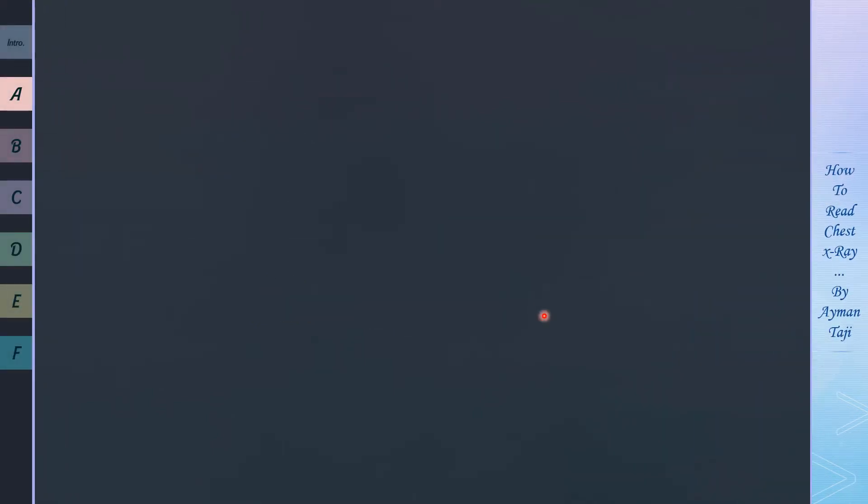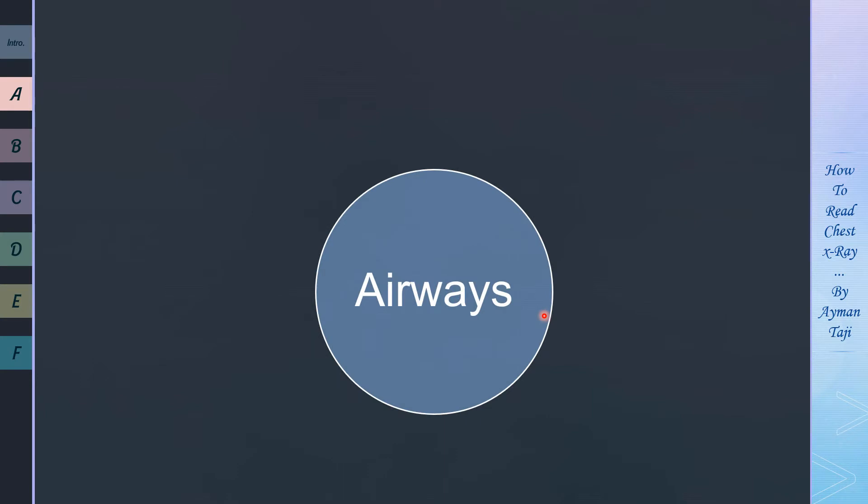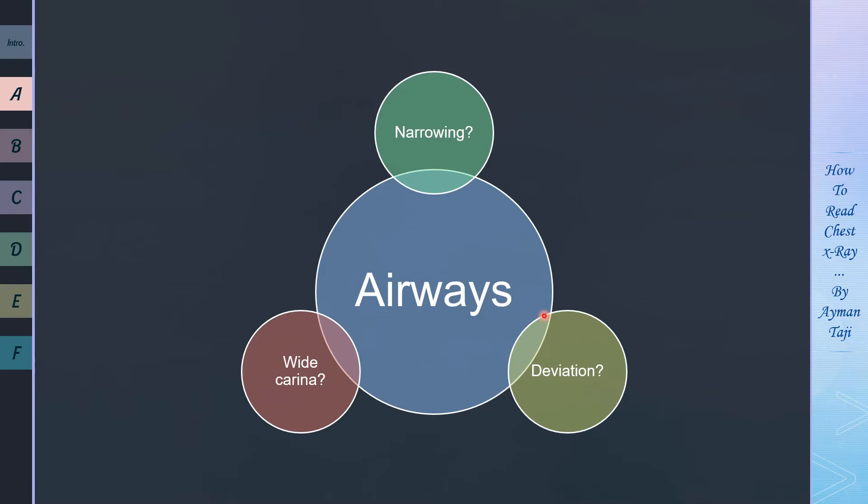When you check the airways you ask yourself three questions: is there any evidence of narrowing? Is the trachea straight and midline or is there any deviation? Is the carina wide, more than 100 degrees? By the way, carina is where the trachea bifurcates into left and right main bronchus.